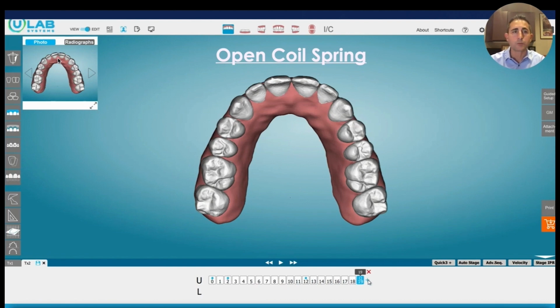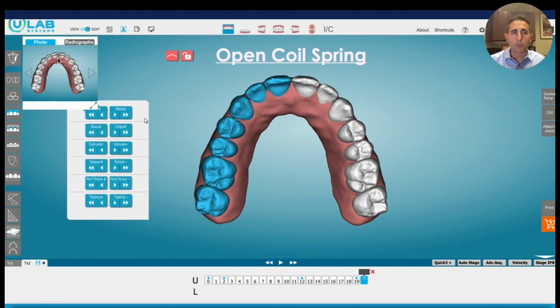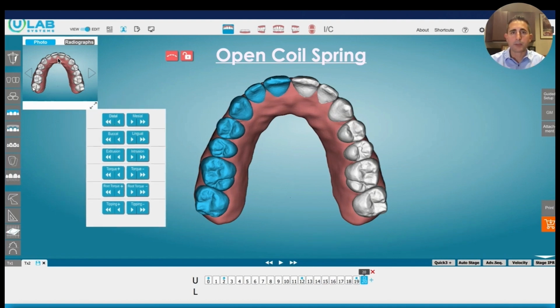What is the easiest way to make space? All right, with braces, we might use an open coil spring. And with aligners, we're going to do the same thing. Now, if this looks crazy to you, that's okay. Go back and watch the webinars, and we set up the foundation of why this works.